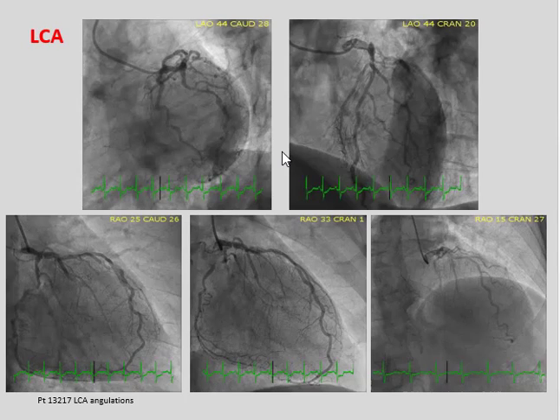Let's have a look at the left coronary artery, which is more difficult because it's a more complex vessel. And we take more views. We take 5, 6, sometimes 7 views as opposed to those 3 views in the right coronary artery. I'm comfortable with my explanation of the right coronary artery. I'm comfortable you should have followed that. Let's see how we go with the left coronary.